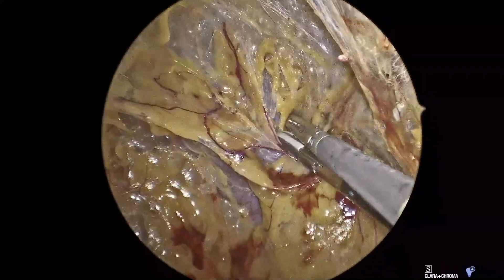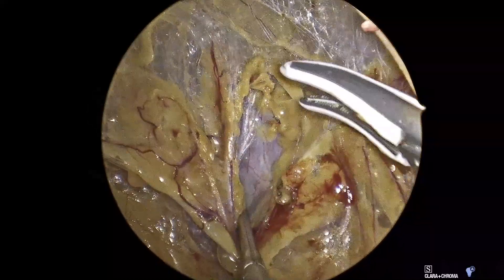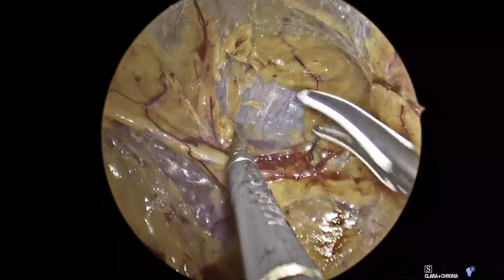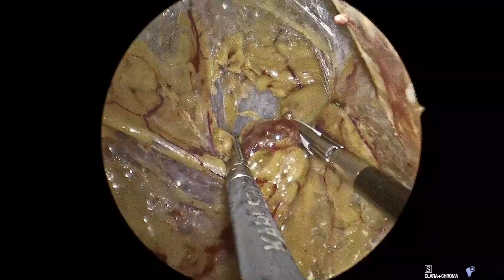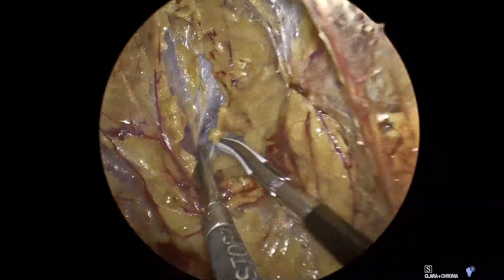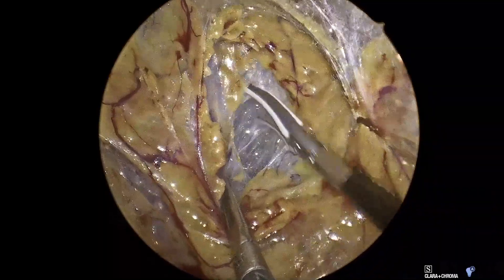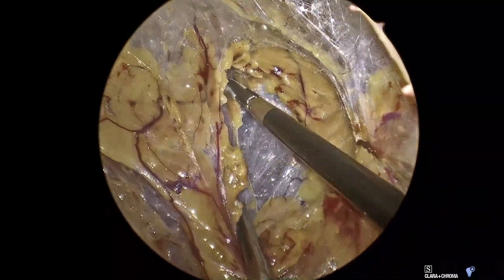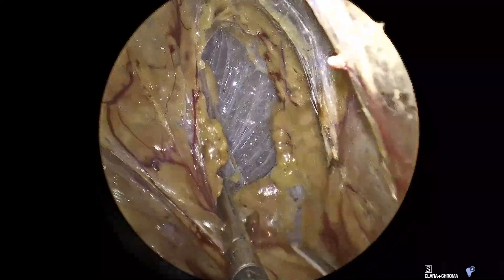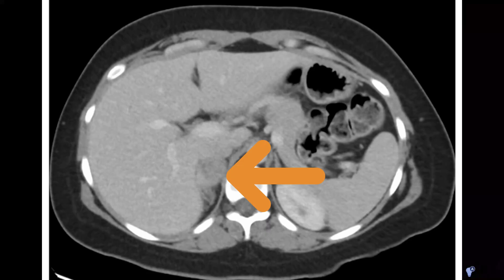She was preoperatively blocked with an alpha blocker for two weeks. On imaging, she had a right three centimeter adrenal tumor with an imaging phenotype which is quite typical for a pheochromocytoma. The family history is non-contributory, but the Karling Adrenal Center recommends genetic testing for all pheochromocytoma patients. You can review the CT scan here showing a right adrenal tumor.